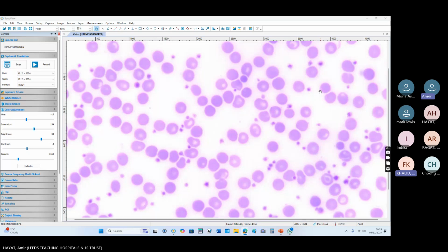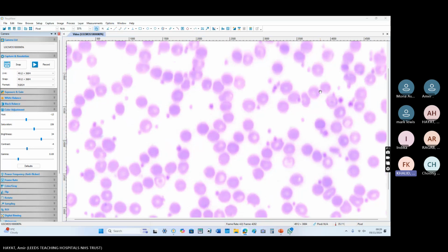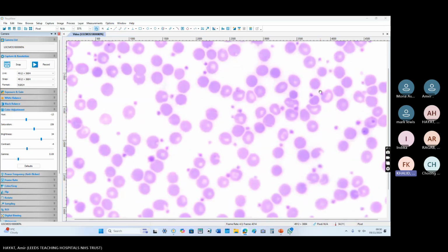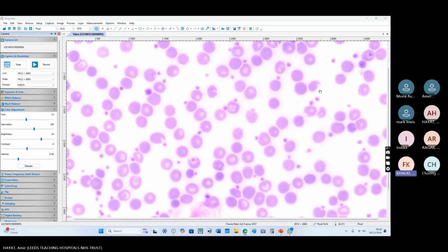Reactive thrombocytosis, given the history, has tons of causes. If you add the context of a Howell-Jolly body, it could be secondary due to a ton of things. You have viral infection, you probably have bleeding, infection, inflammation, iron deficiency. You have a couple of things going on here which would add to the picture of thrombocytosis. And the other question, which I should have mentioned earlier, is are there any previous blood counts to compare?